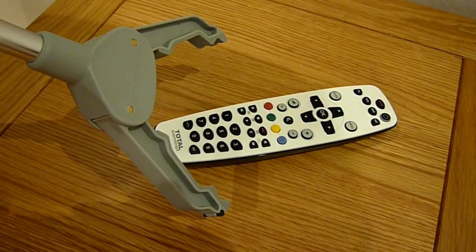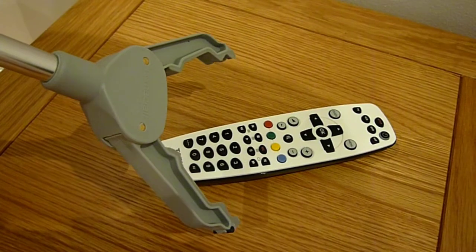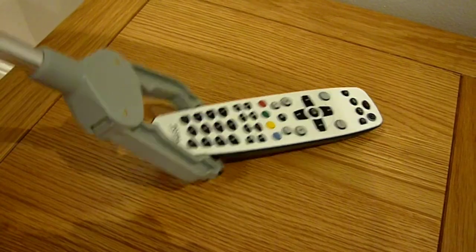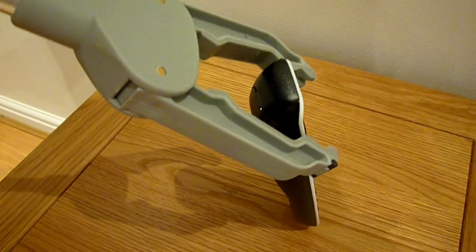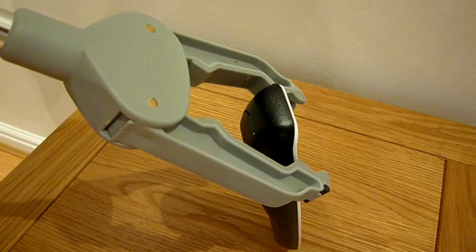To demonstrate why our client requested this design, first we'll show you how the standard Reacher works by trying to pick up this remote control. We're going to pick it up at the back to exaggerate the principle. As you can see, the standard design is only able to pinch the sides, which means that you need to maintain a strong grip to prevent it from dropping.